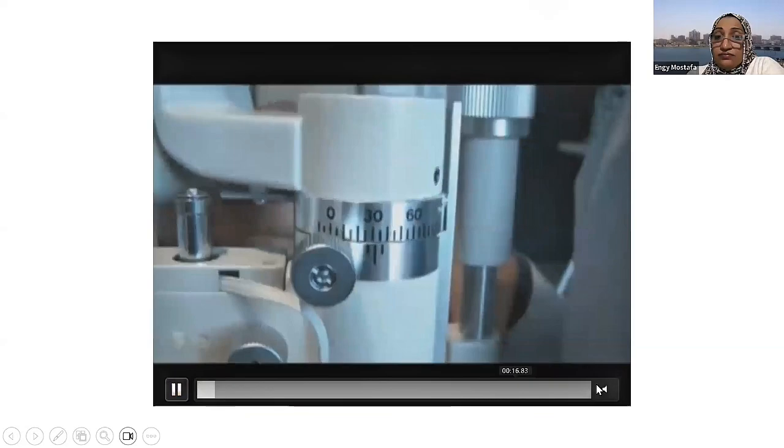Let's say that we are going to have some questions like what's parafocality of the slit lamp? The normal answer would be that it is the way that light and the viewing system coincide on the same spot.